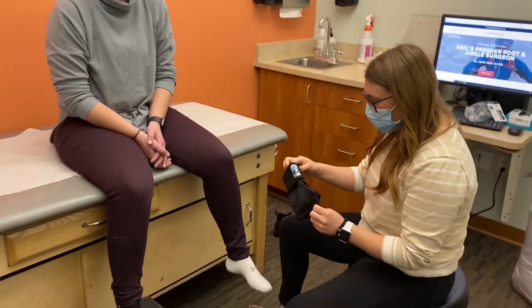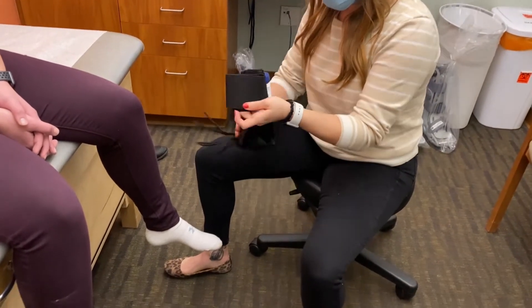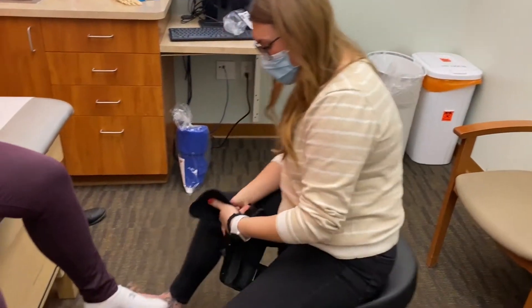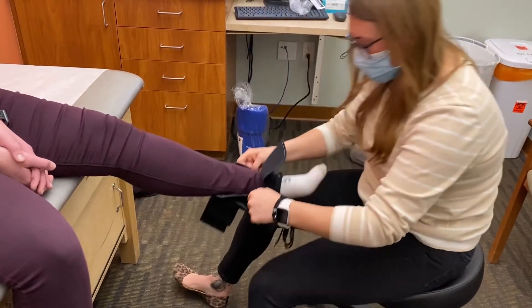This is typically how the ASO brace comes packaged. What we do is undo all the straps. You'll notice there's a hole in the bottom — you'll slide your toes through like so, and the heel will sit in the back.